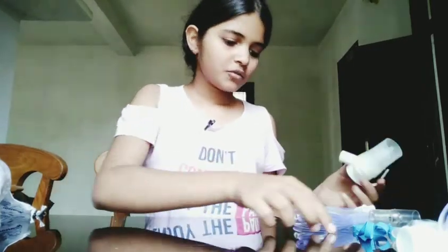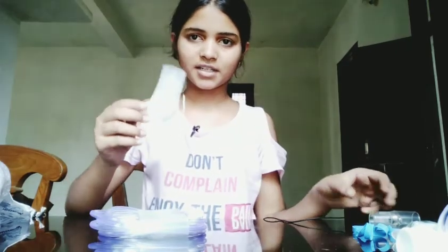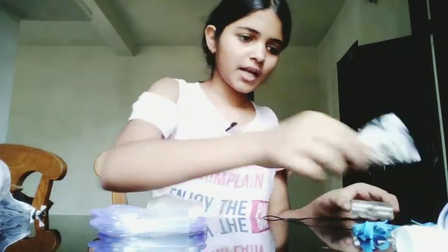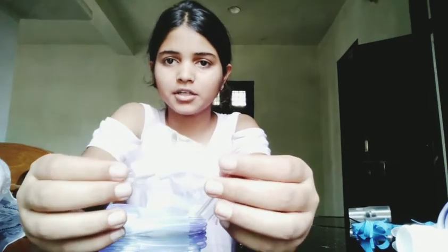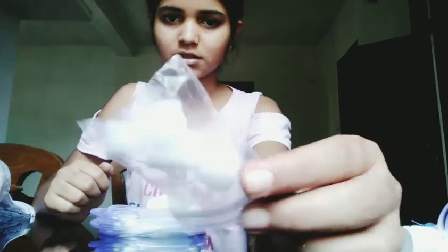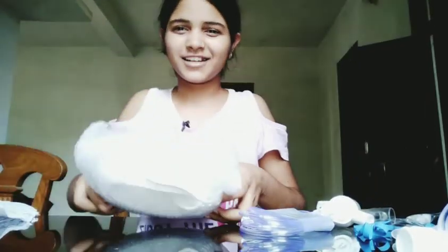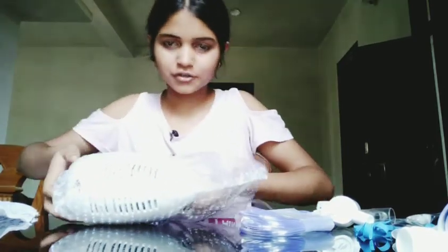Now let's move on to connecting. First, let me show you what you get inside: this is a wire and this is a connecting tube. This sponge-like thing is actually an air purifier — you need to change the air purifier after some days. We get some extra pieces; five pieces total, and one is already connected inside.